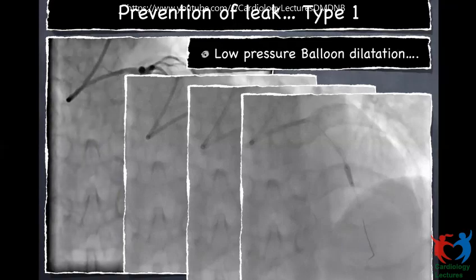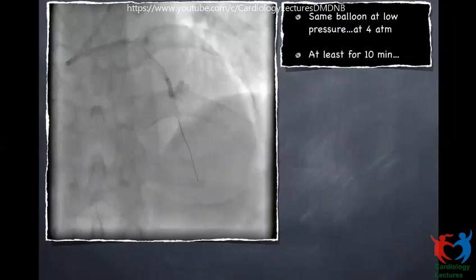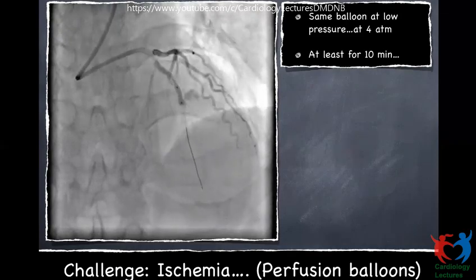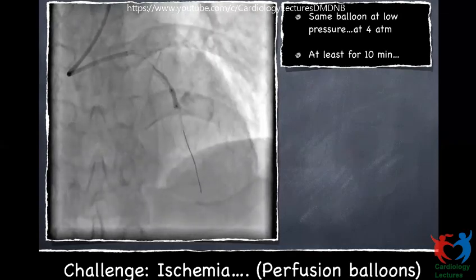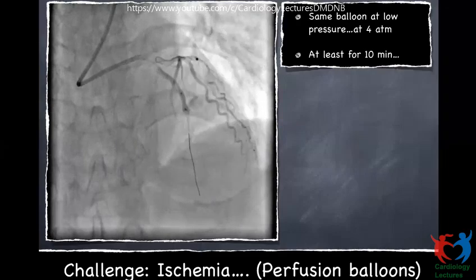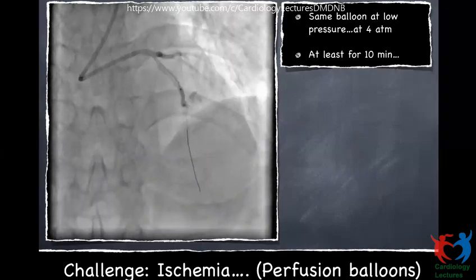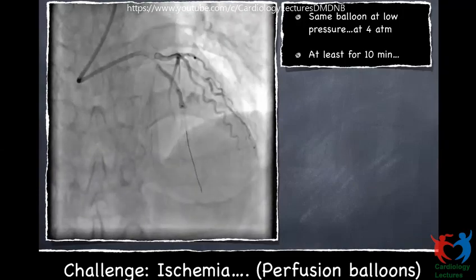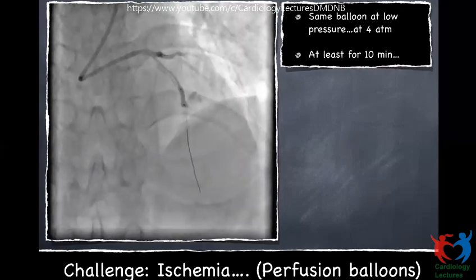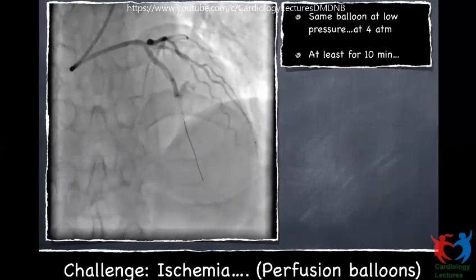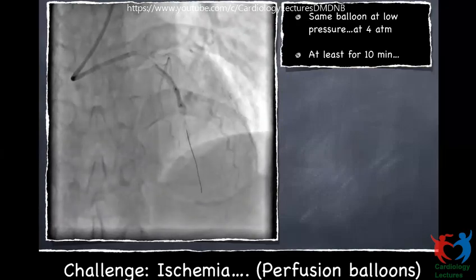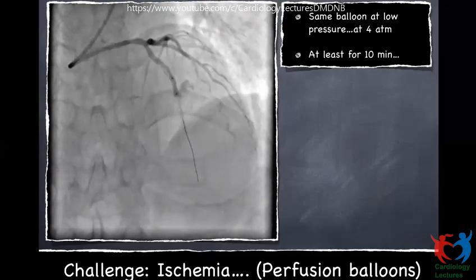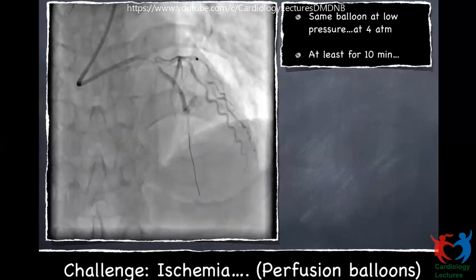Once you see uneven balloon expansion, you know it is likely to produce a perforation. The next shot showed a Type 1 leak — not going into the pericardium. The knee-jerk response was to dilate that balloon at low pressures right there. The most important thing is to recognize the perforation before pulling the balloon out of the coronary. Every time you do a stent implantation or post-dilatation, before pulling out the balloon into the guide catheter, always take a small check shot. Make sure there is no dissection or perforation, then pull out the balloon catheter.